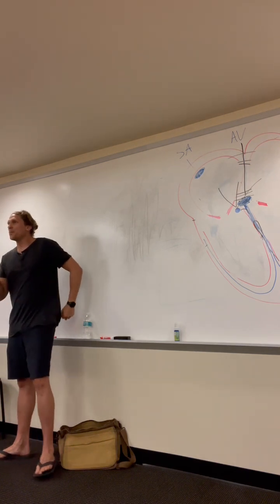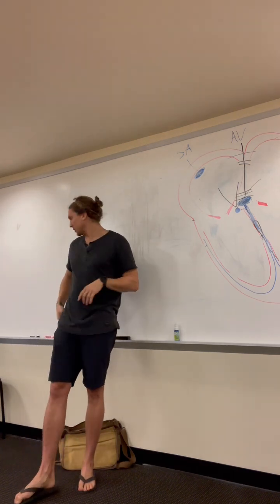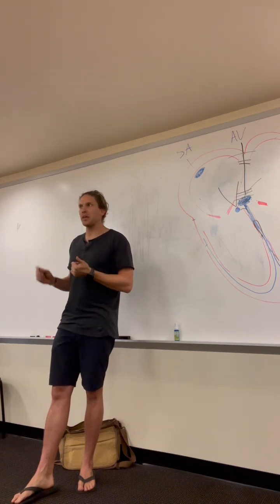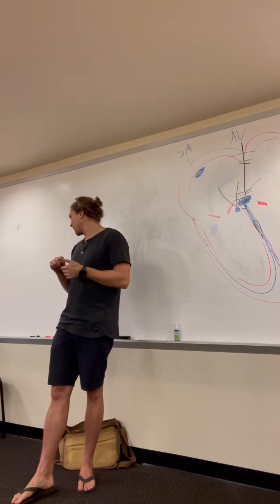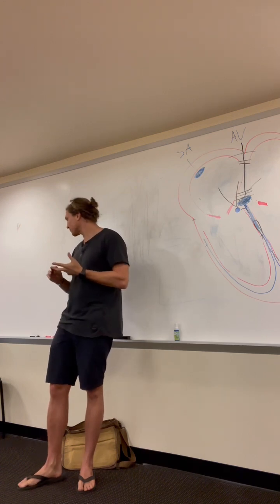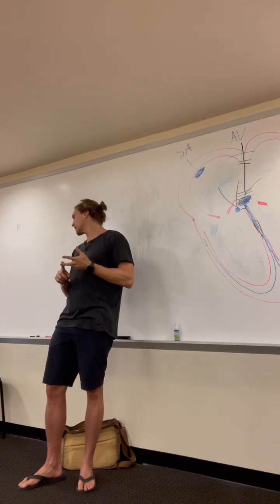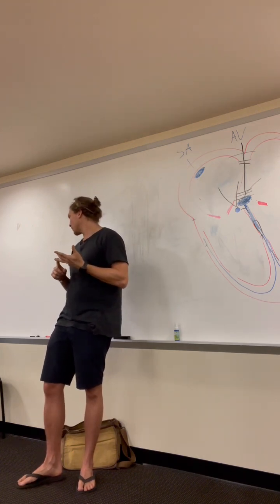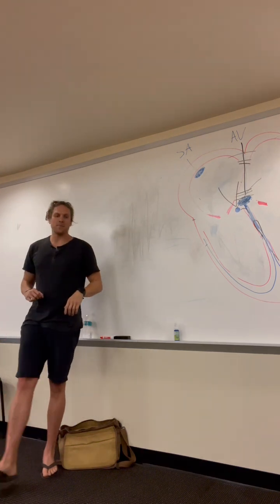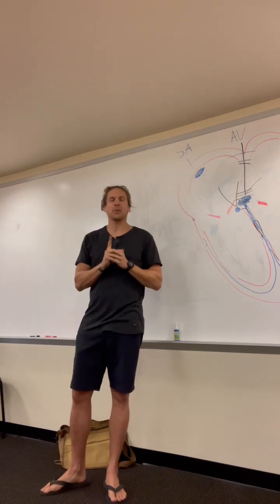Before we go to third degrees, let's go over some rhythms that could be confusing to these heart blocks, okay? They're sinus arrest. Let's do sinus arrest methodically, okay? Rate, 40. Rhythm, there's a P for every QRS and a QRS for every P. It's a narrow QRS, so it's coming from the sinus node, sinus arrest. And intervals look good to me. If it was a prolonged PR interval, it'd be a type 1 heart block or a first degree heart block, okay?